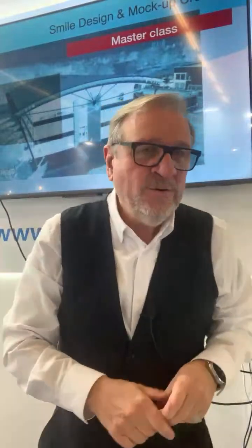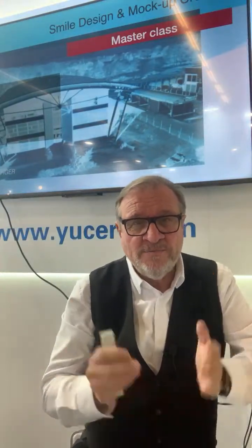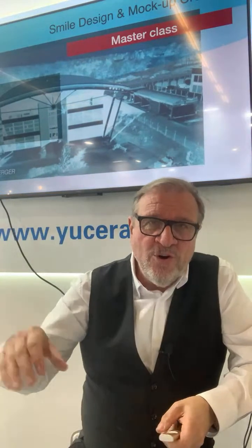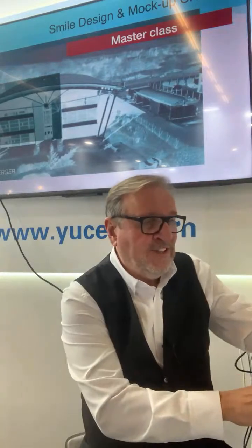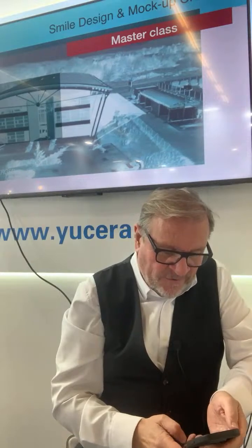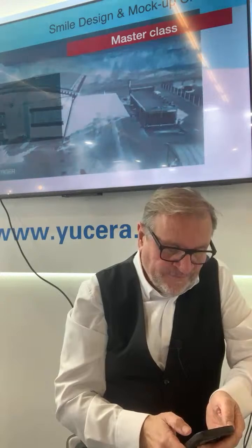So we try to show you now the smile design and mock-up creation, and thanks for being with me. This day was really focused on the workflow to have the best result in this area. And now I'll just have a look if I can show the things myself.